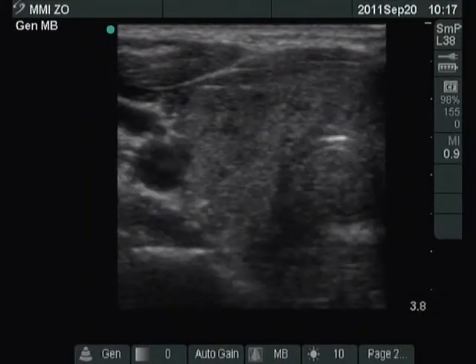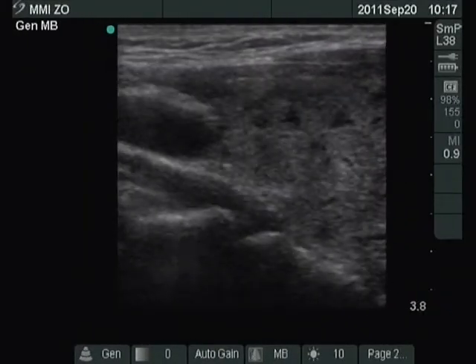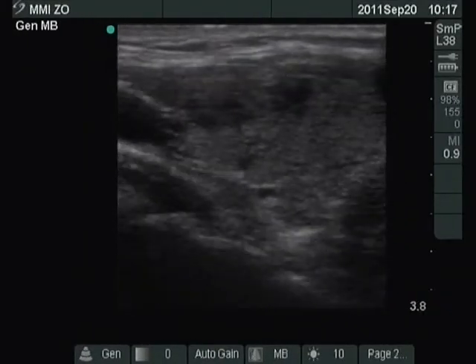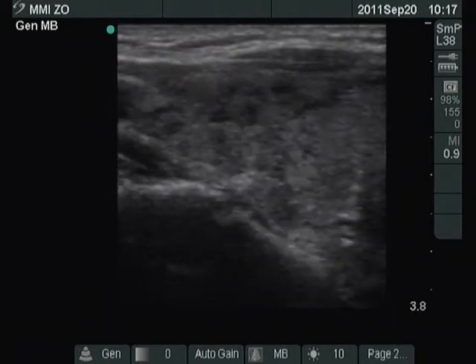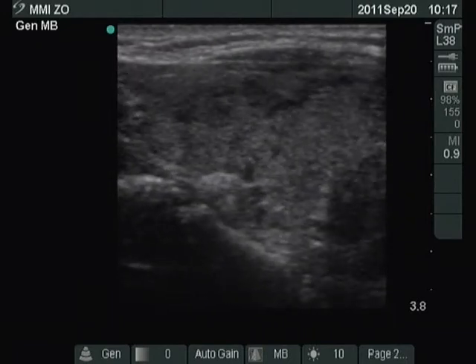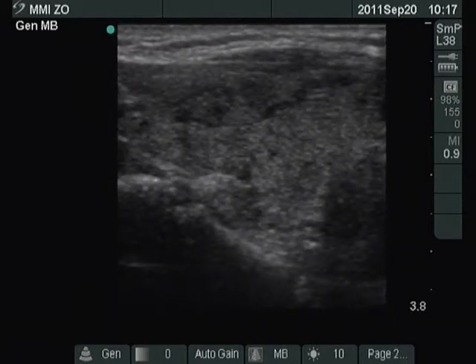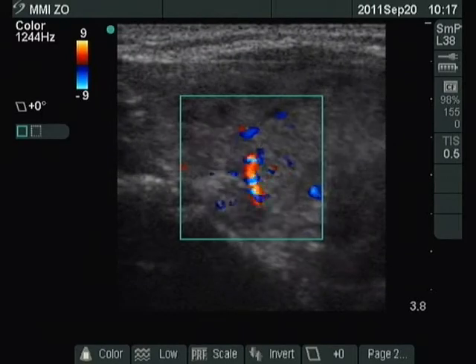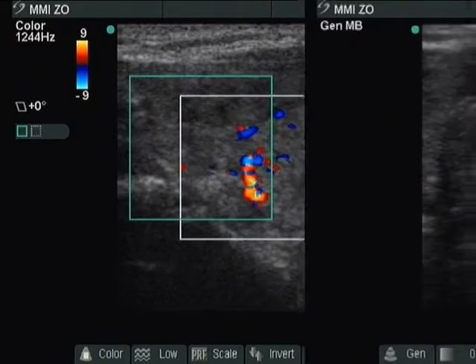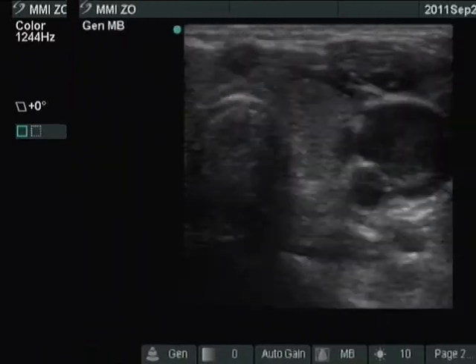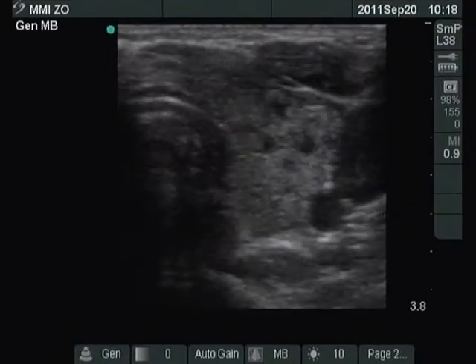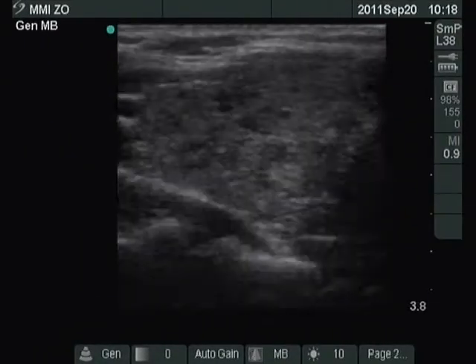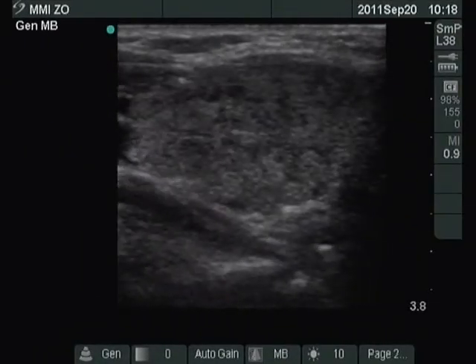The right lobe is echinormal and contains hypochogenic areas. The echogenicity index is around 15%. The left lobe has a similar appearance. This pattern corresponds to Hashimoto's thyroiditis.